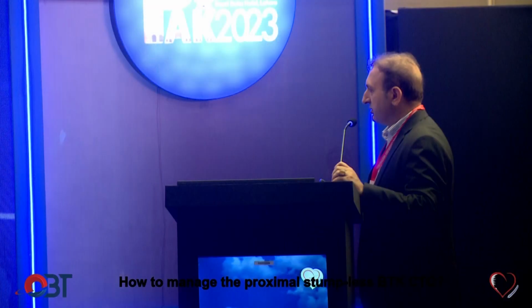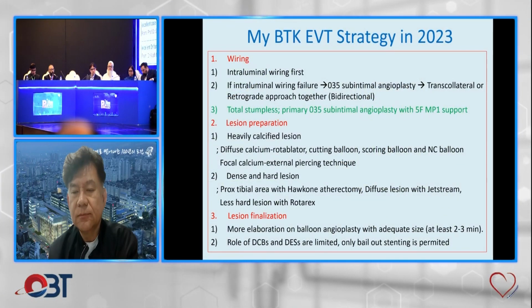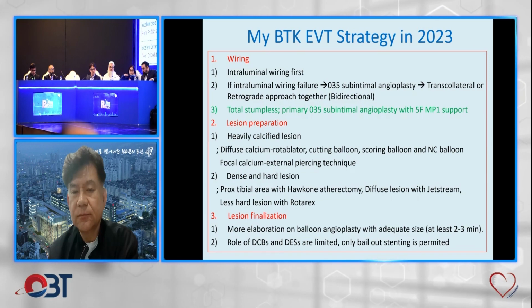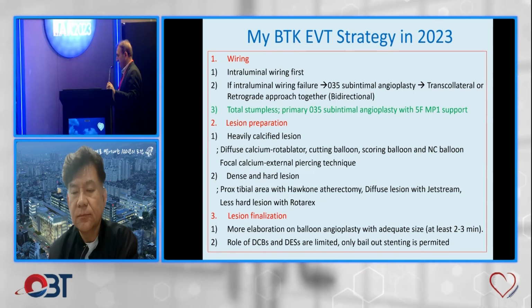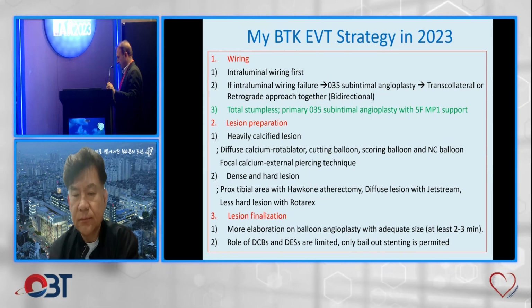I think it's an excellent presentation, and I really like his application of coronary CTO technique, specifically crossing the long lesions with a subintimal approach with a knuckle wire. It can cut down the procedure duration and also cut down the risk of perforation or rupture in the artery, because subintimal space is amazingly flexible.